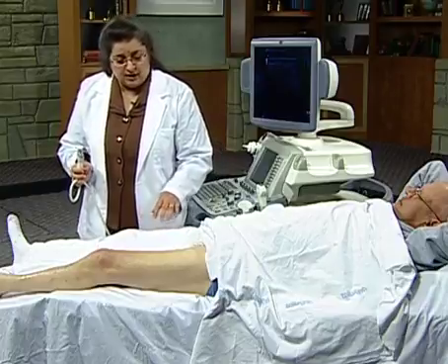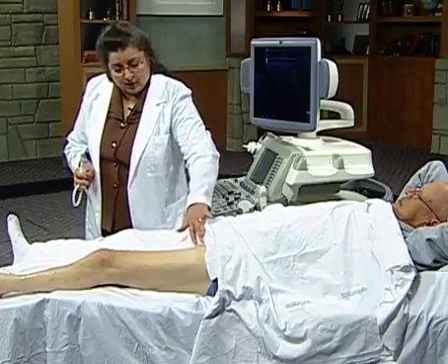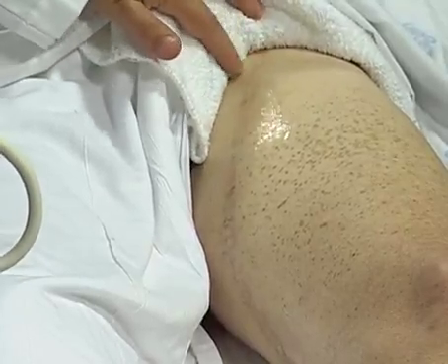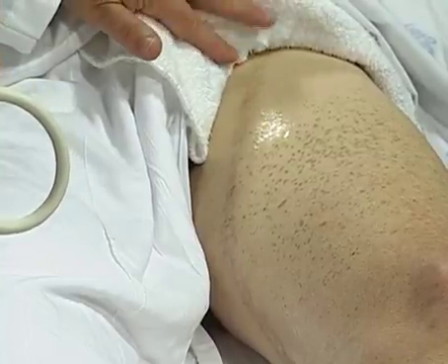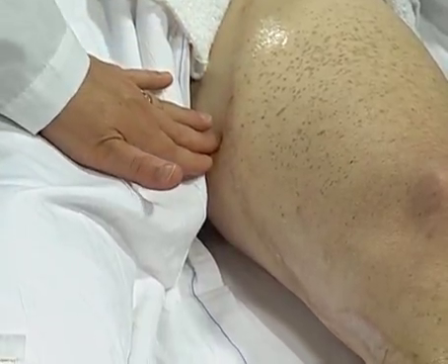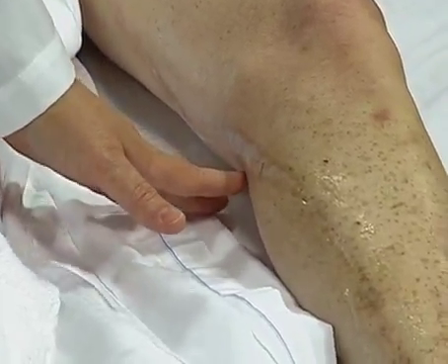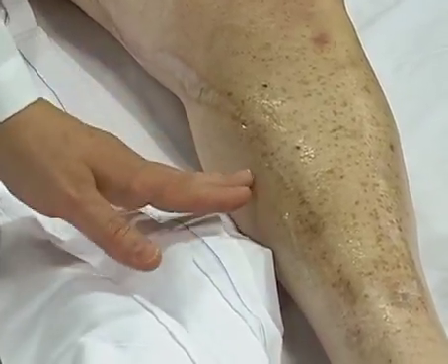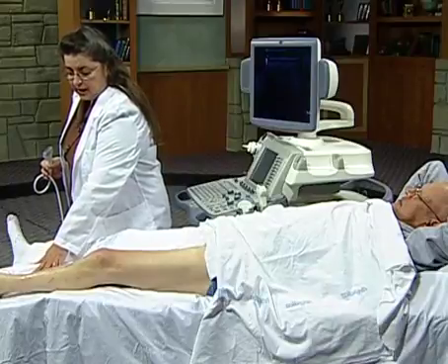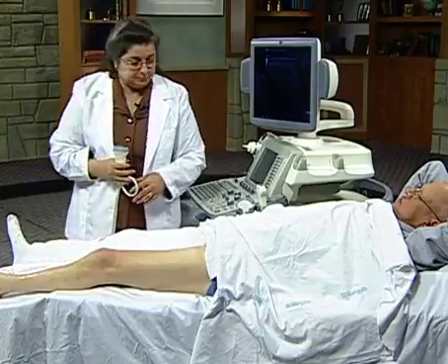And we should take a look at the patient's limb, and the information that we can obtain for where the incisions are placed will help us out. We see that in this case, the incision really starts quite high, right at the groin crease. So probably the anastomosis is to the common femoral artery or very proximal superficial femoral artery. Then the incision courses along the medial aspect of the thigh, right along where the saphenous vein would have been naturally, coming down behind the knee, continuing on to the calf, and going all the way down here and ending just above the ankle. Now in this region, the anastomotic options would be either the peroneal artery or the posterior tibial artery, so we'll see where this goes as we scan.